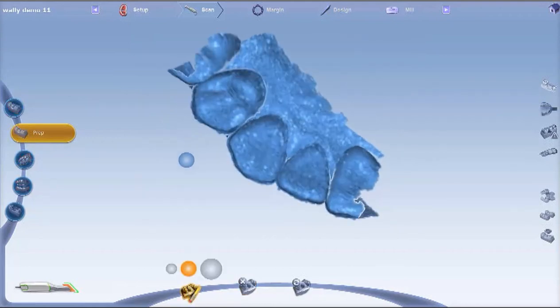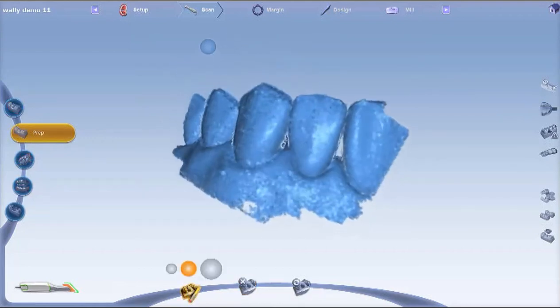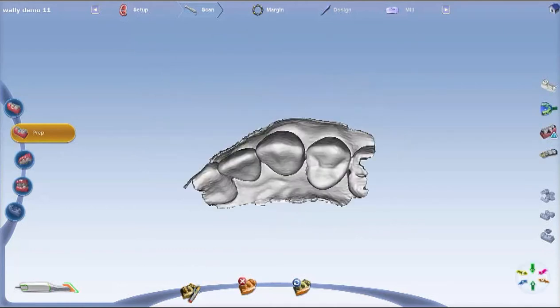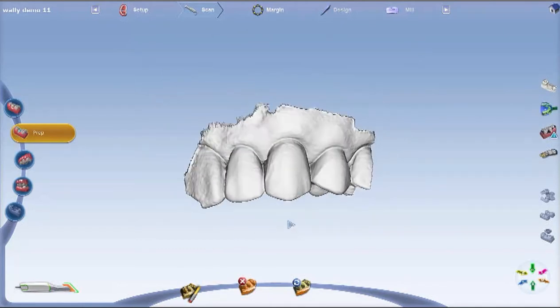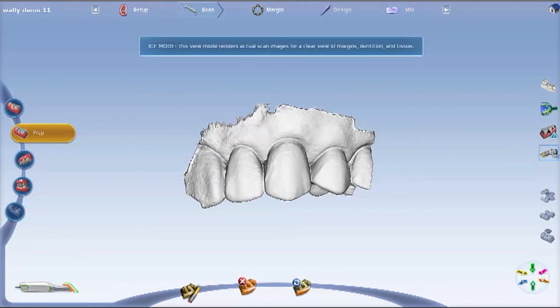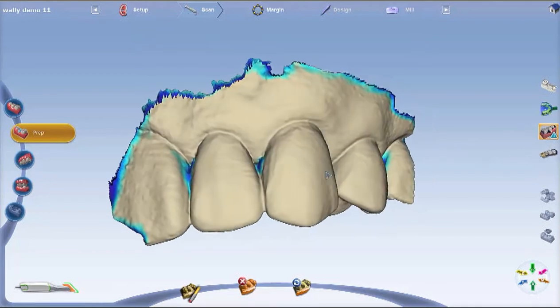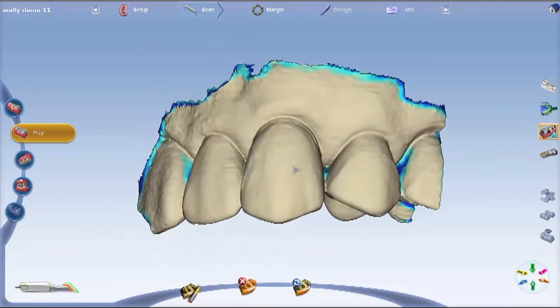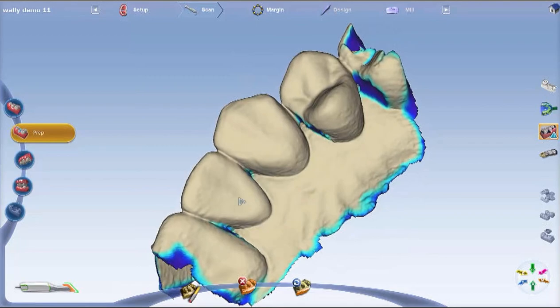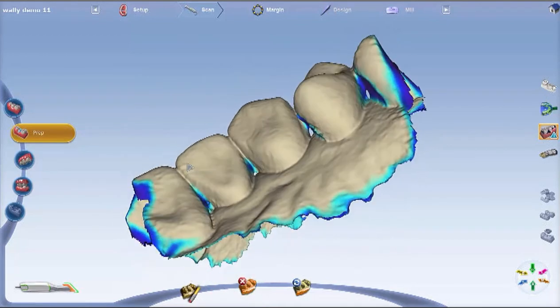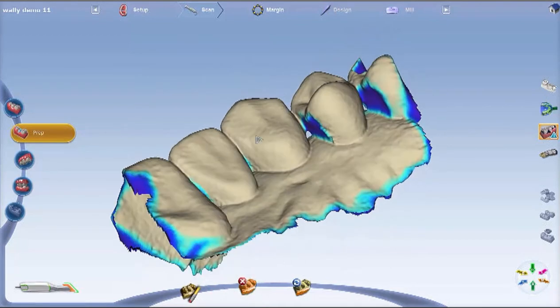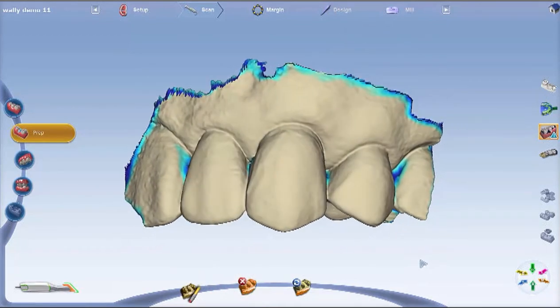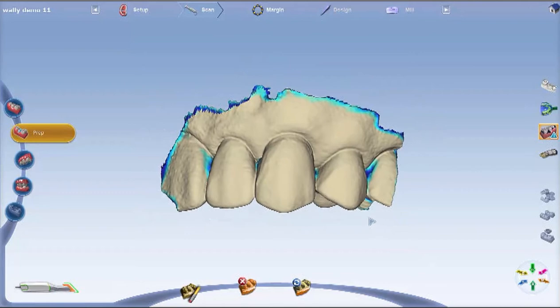Generate your model and immediately check for low data by hitting the exclamation point right there. It's okay to have a little bit of blue deep within your embrasures, and if you have some blue on adjacent teeth it's not the end of the world.